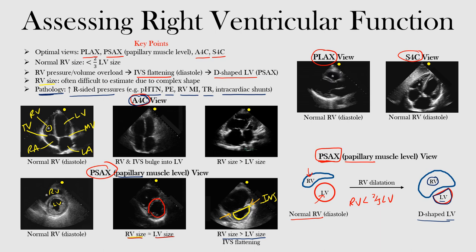In the middle image of the apical four chamber view, this is your right ventricle. Notice that now you have right ventricular and interventricular bulging into the left ventricle. The septum between them, instead of going straight, is now curved — the pressure from the right side is pushing over and causing that bulging into the left ventricle. In the third image, the right ventricular size is greater than the left ventricle and you have that interventricular septum pushing over to the left side.